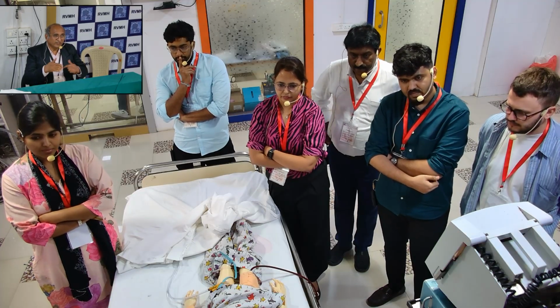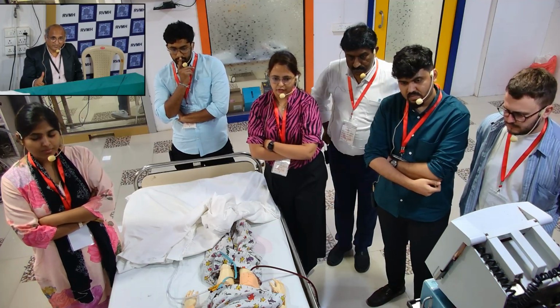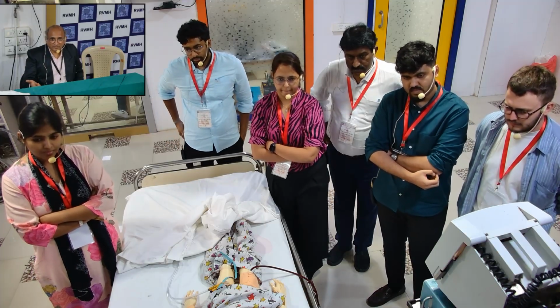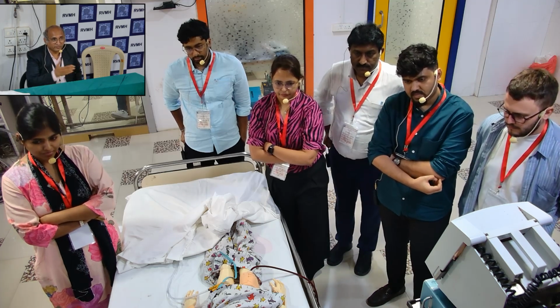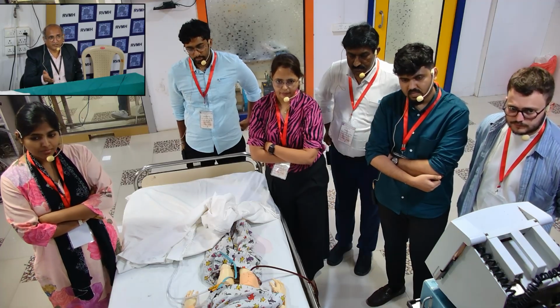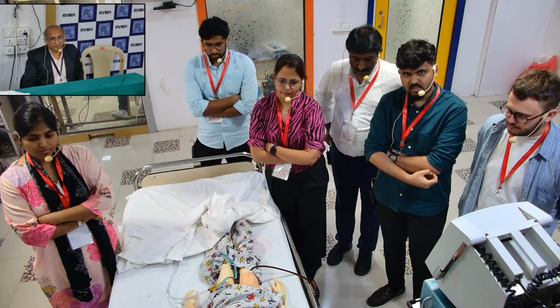Okay. So these are the few things that you need to understand: circuit related complications are sudden and drastic, they are easy to solve, and they can be life threatening. You have seen how rapidly the patient has gone into bradycardia and hypotension: first it was a tachycardia, and then immediate bradycardia and hypotension. That is what typically happens.